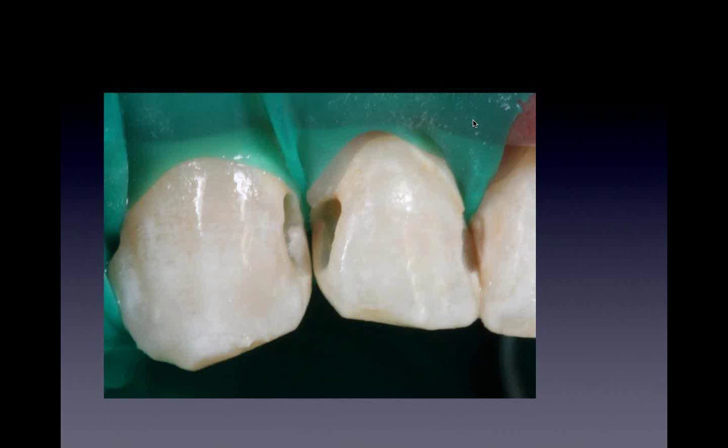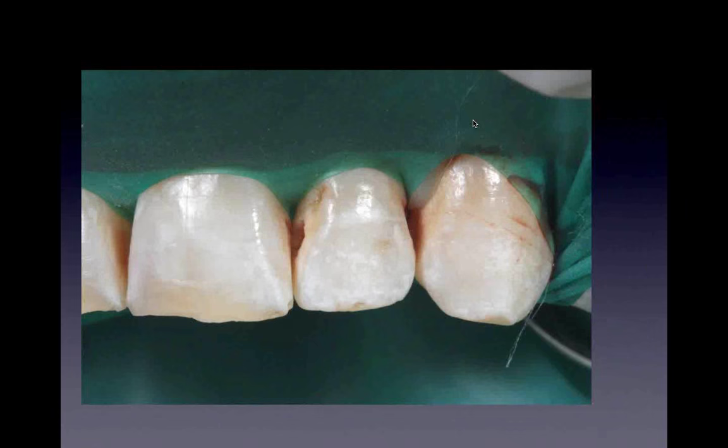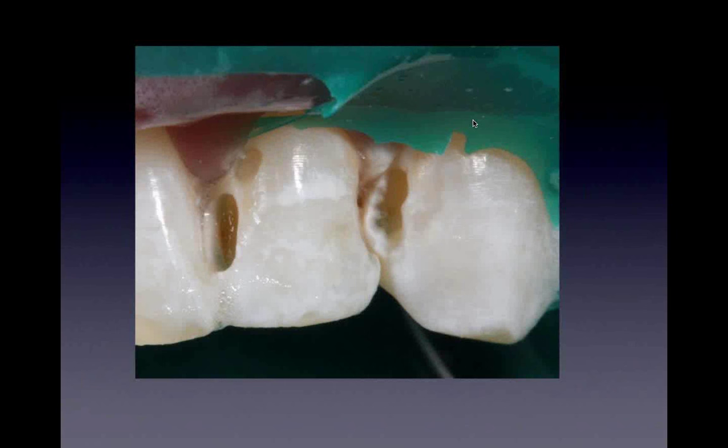And you're on. Okay, so we basically just do regular decay removal. I like using round burs, round diamonds for this, just to get out the decay. Here's the left side. Now, these calcifications are the interesting part.